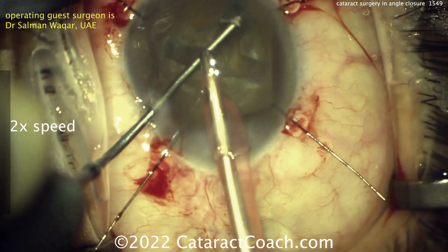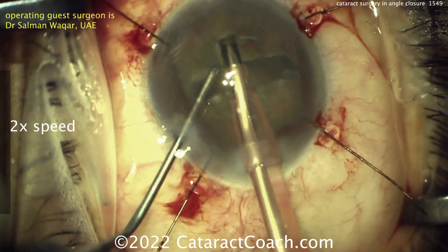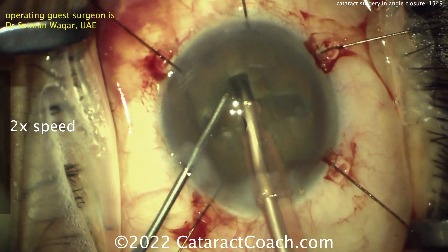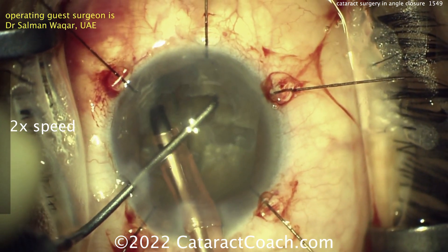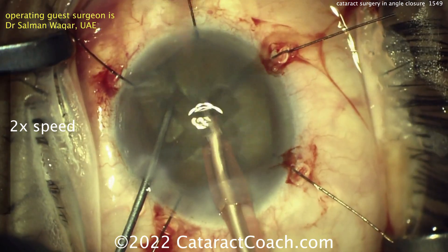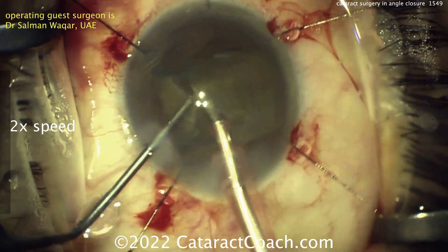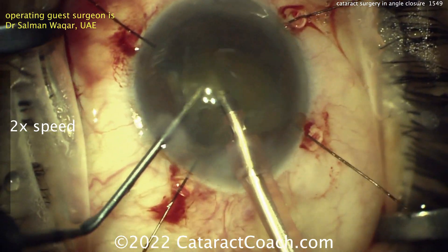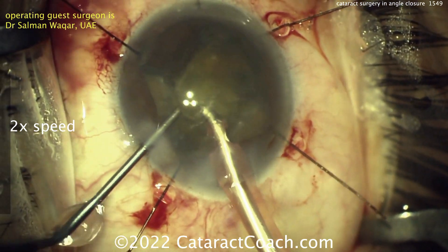I'm a big fan of chop — I love Vaco chop, it's my go-to, my fastball. But in a case like this, there's a lot to be said for doing divide and conquer or stop and chop because of the added benefit of debulking the central nucleus, which is of course the densest part. So now each quadrant is smaller than 25%, maybe 20% of the total nuclear volume. Those can each be brought up now and aspirated pretty easily, and this is going very well.